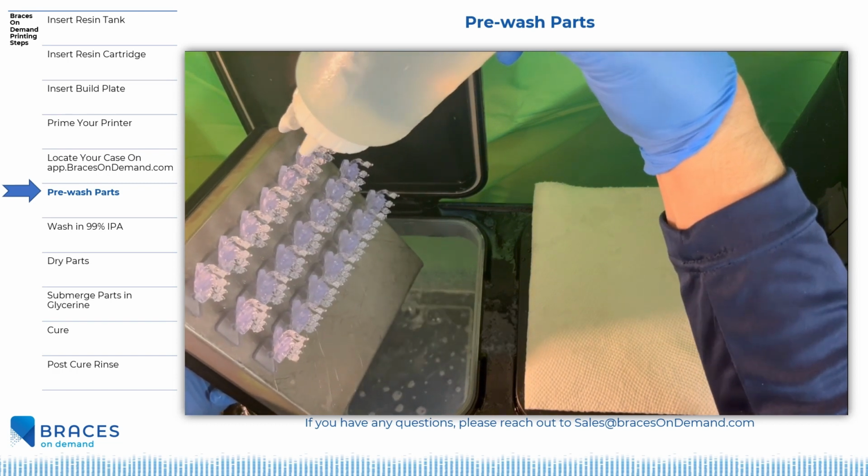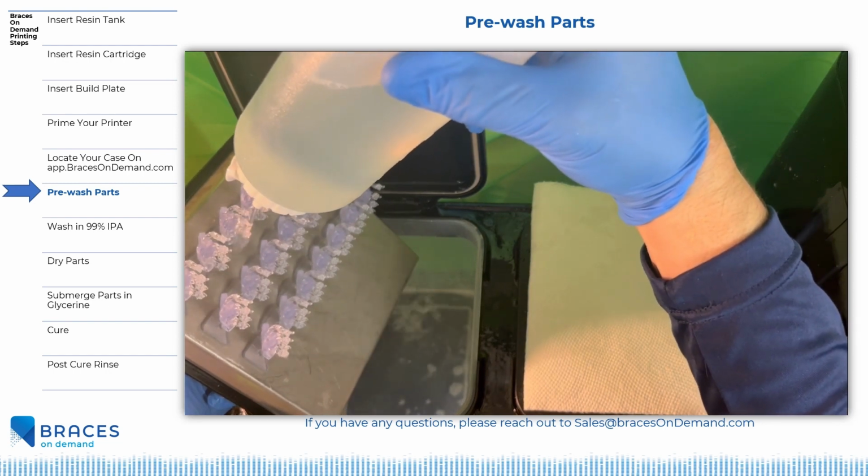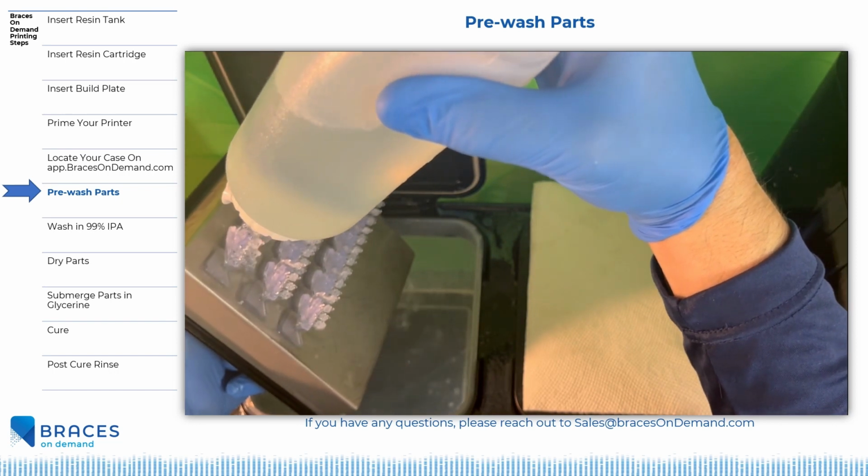Be sure to give extra attention to the bracket slots and tubes where resin may accumulate. While we watch the pre-wash, we have time to answer some frequently asked questions.